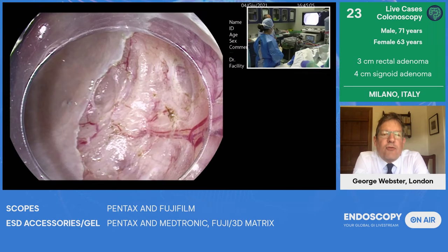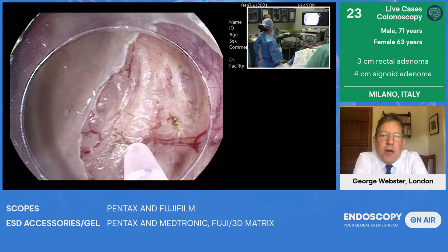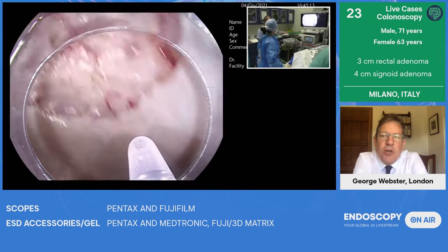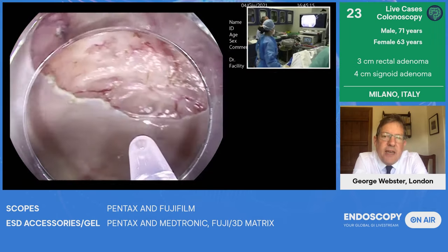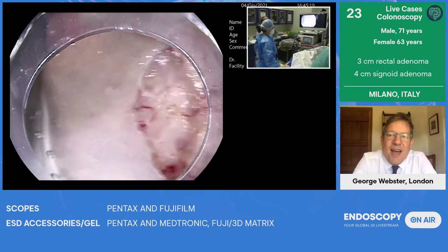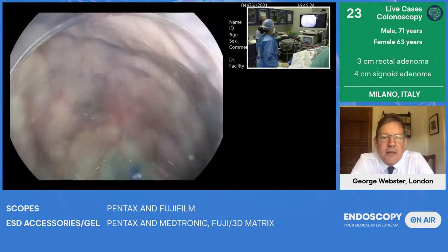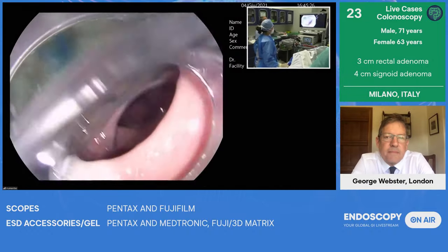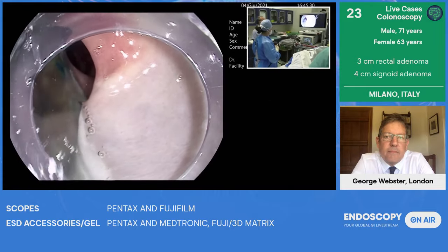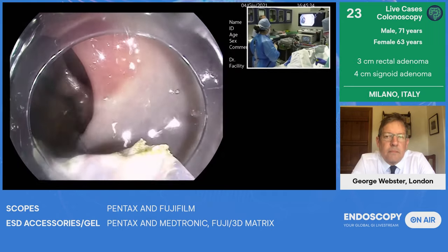Does EMR have a role in this case, or would one always say, in 2021, in the setting of IBD, that flat lesion should be resected with ESD, or can one defend the position of doing an EMR in this case? So in 2021, this type of lesion, for two main reasons, because of IBD and because we are in the West, should be removed en bloc. En bloc doesn't mean ESD or EMR, but means en bloc.